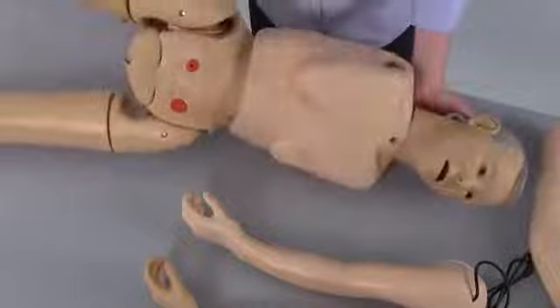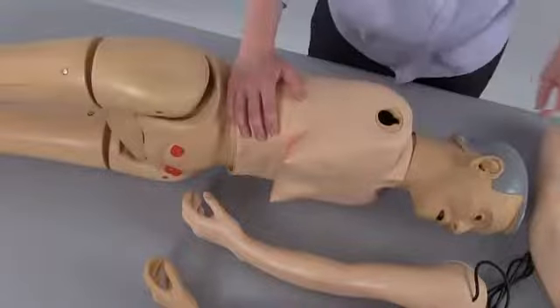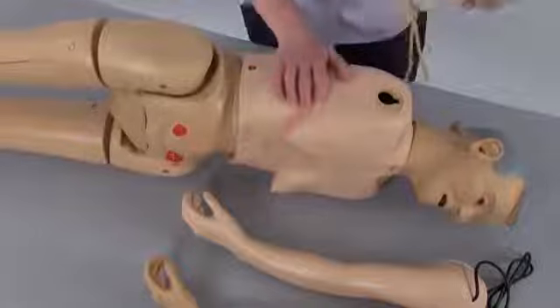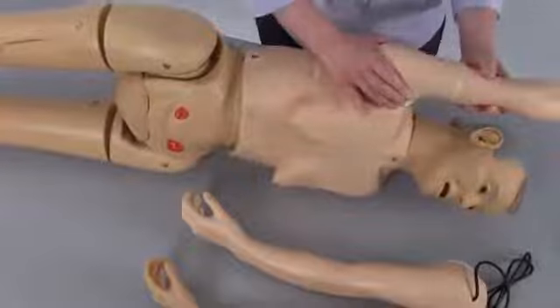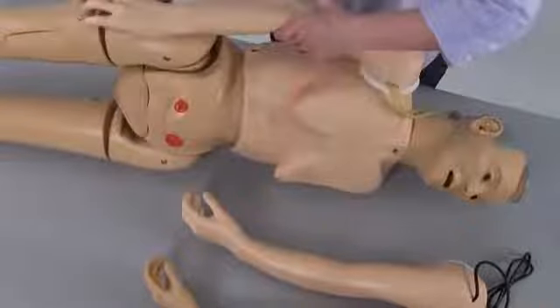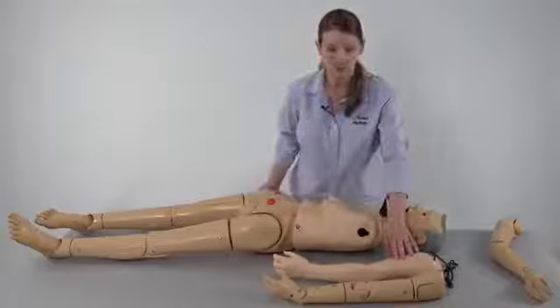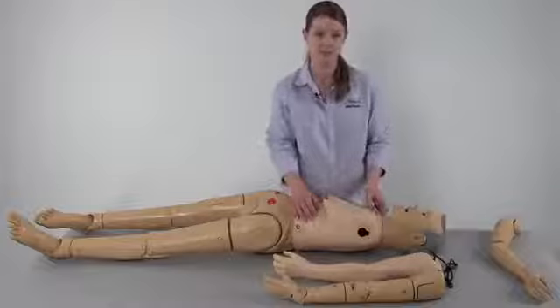Gently roll the mannequin, exposing the keyhole on the side of the upper torso. Align the keyhole on the arm with the keyhole on the upper torso. Slide the arm into place and misalign the keyholes. Both the intravenous arm and the blood pressure arm, as well as the articulating arms, attach to the mannequin in the same manner.